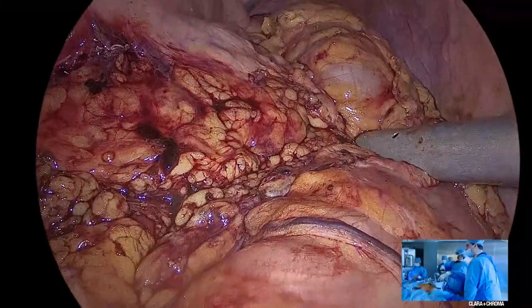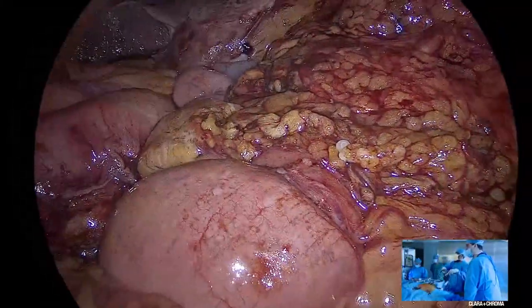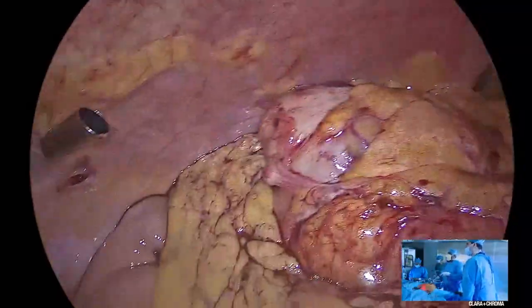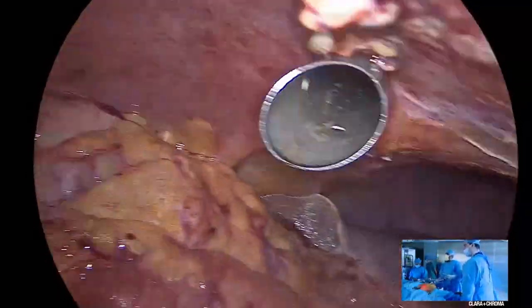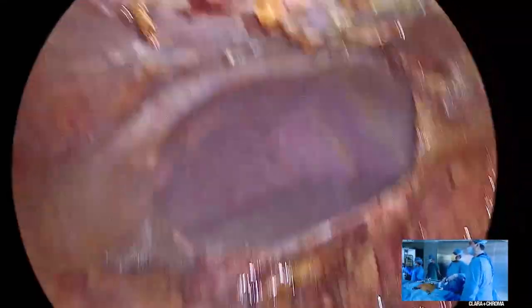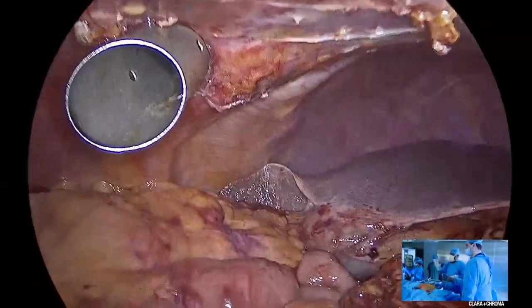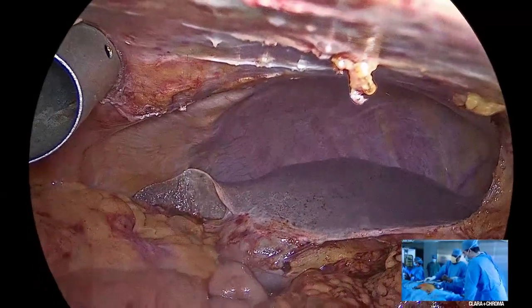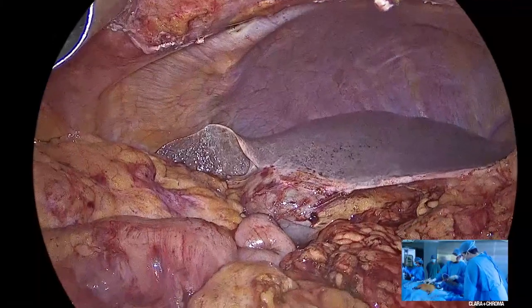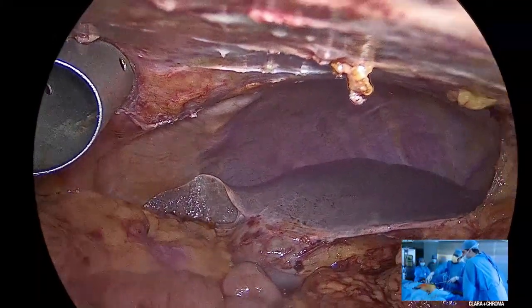So that will be my distal resection margin, which is 10 centimeters from the hepatic flexure, from the tumor. And the proximal resection margin will be the terminal ileum. And all of this is adhesions from previous surgery, which we have taken down. So I think that's the end of the laparoscopic part. What I'm going to do now is, as I showed you earlier, make a 5 cm incision. All of it is completely mobilized, so it should reach out. It should come to the ceiling quite nicely.